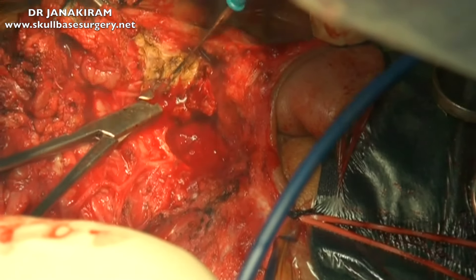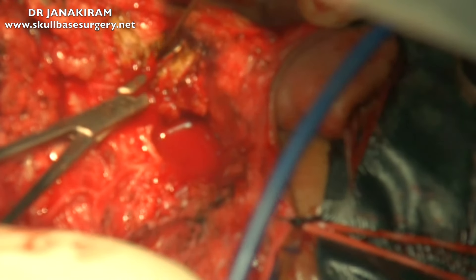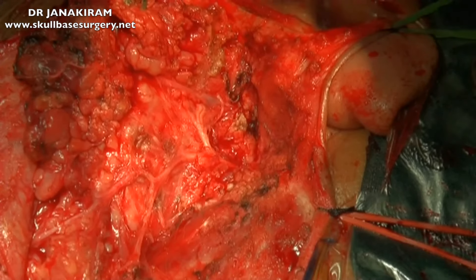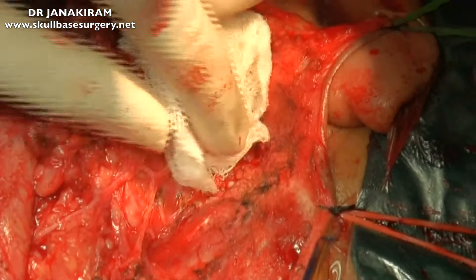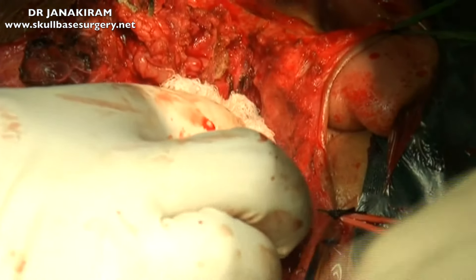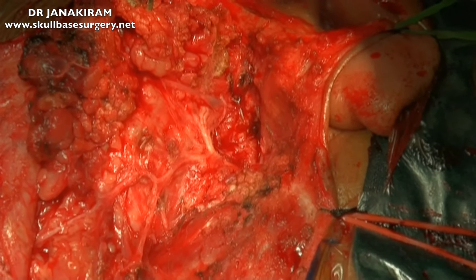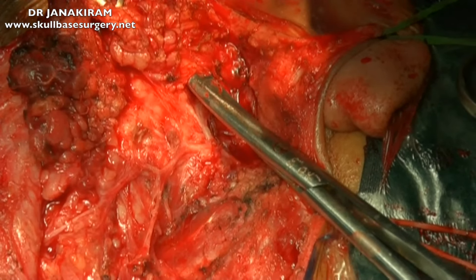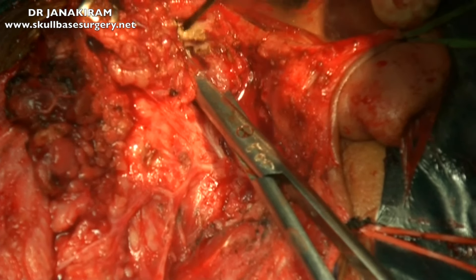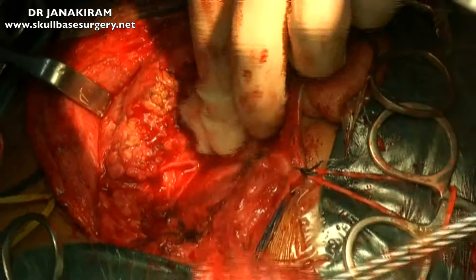Here you can see that we are using a unipolar, though this is done far away from the nerve. Once we visualize it through the microscope we will see that very clearly. You can see very beautifully that every branch has been traced — the cervico-facial, the zygomatico-temporal — and we will trace it right till its supply. Now once we do that, we are going to take off the gland in one piece. We identify a branch, use an artery forceps directed upwards, and that is the gland being removed in total.